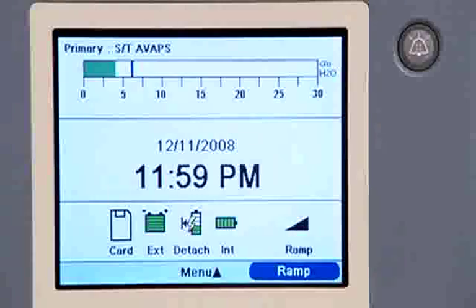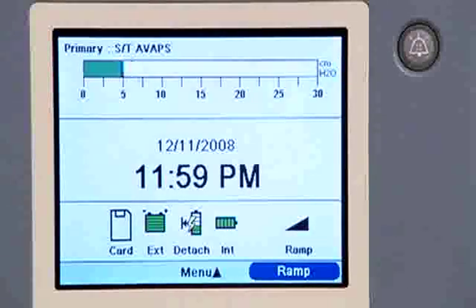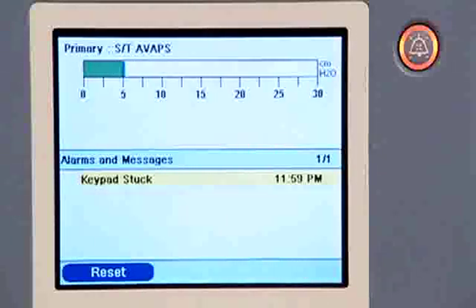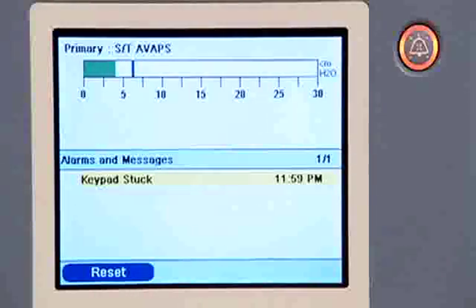Trilogy 100 also has a number of low priority alarms which convey information you should be aware of — for example, a button is stuck or the detachable battery needs to be charged. Low priority alarms are two beeps together in a repeating pattern. The audio pause button shows a solid yellow light and the alarm message is highlighted in yellow.